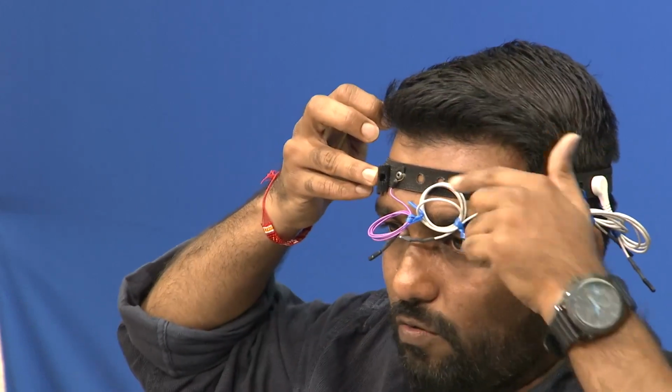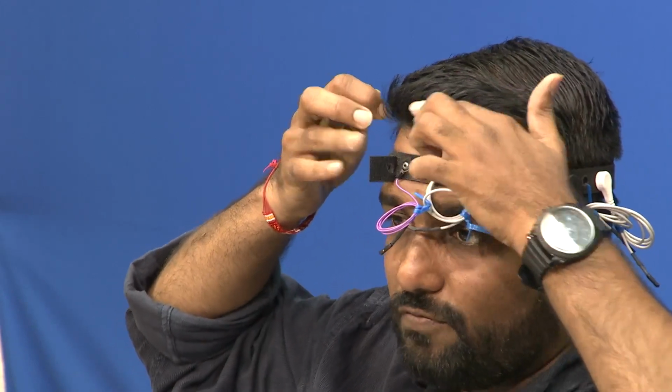This is a headband kit, it is called FRI 2147 from OpenBCI, and the electrode is right over here, this one. Now, because of the band, the electrode is touching the head, and I do not have to use gel because it is a dry electrode, right. This is how the signals are taken. Now, there are certain pros and cons of using wet electrodes over dry electrodes or dry electrodes over wet electrodes, but that is not our idea to see right now. Our idea is to see what kind of electrodes are present and can we use them and how can we use them. So, easy to use.